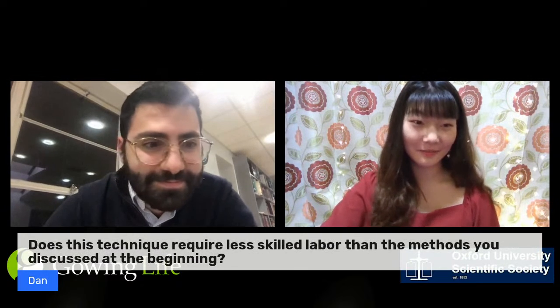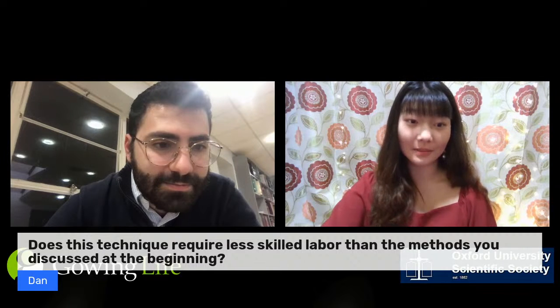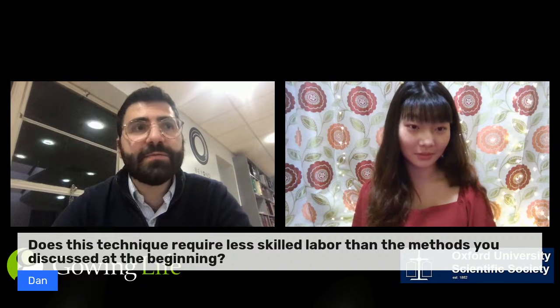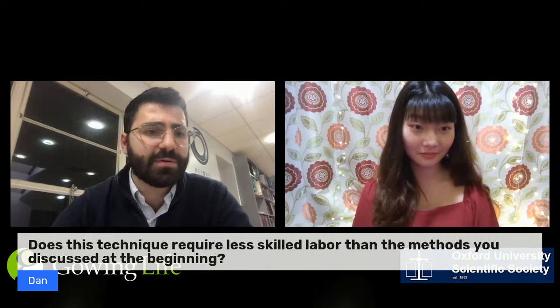Yeah. May we have the next question? Does this technique require less skilled labor than the methods you discussed at the beginning? I suppose we've kind of answered the question. Yeah, so for example, you can deploy fluidics, so things can happen by themselves, but also something like what DNA Nudge does, which is essentially another SARS-CoV-2 test where they make use of a capsule. You add your swab in, then this is biocontained, and then you can just use it straight for imaging. So you can do something similar to that.